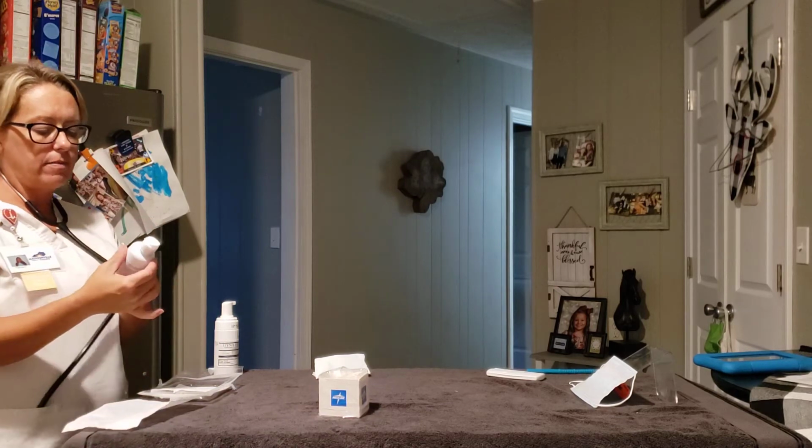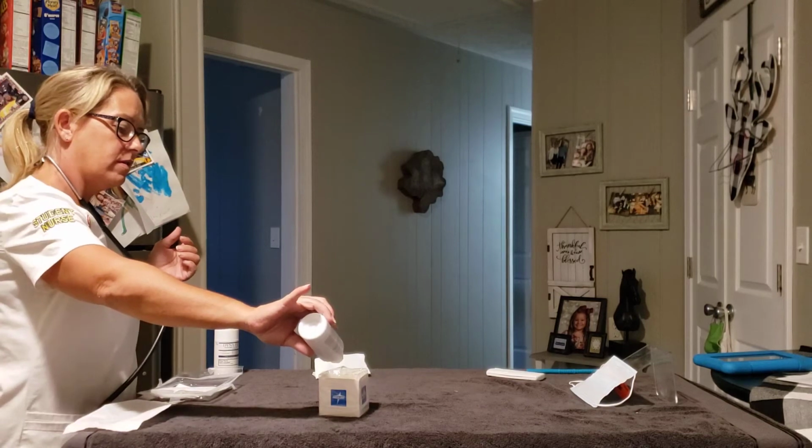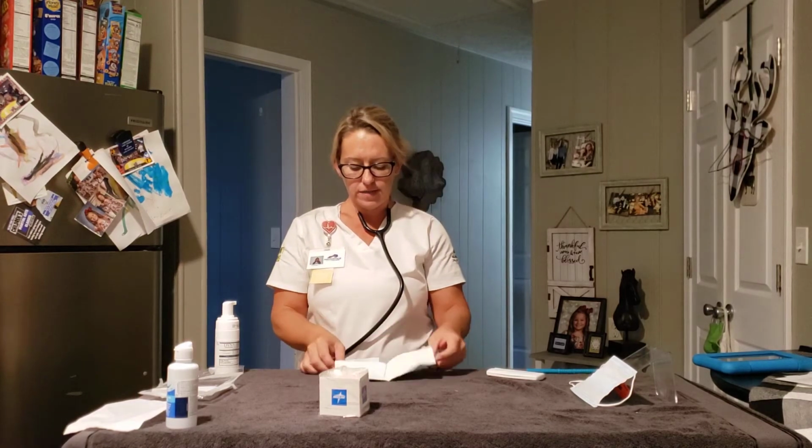Okay, I'm going to go ahead and make sure that my solution is not expired and it looks good. Okay, wash my hands. I'm going to go ahead and put on sterile gloves.